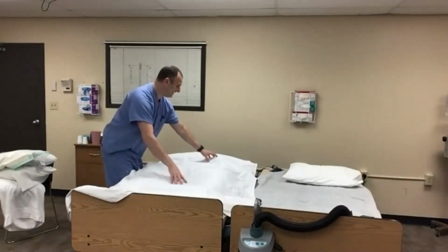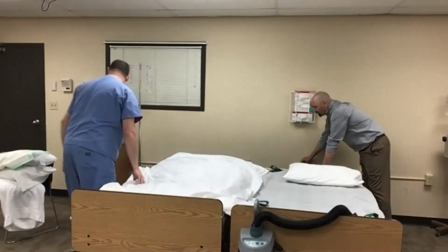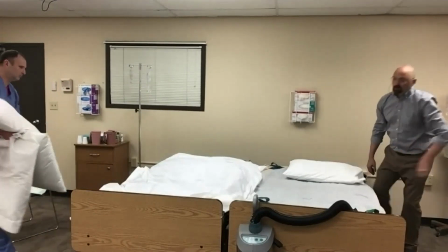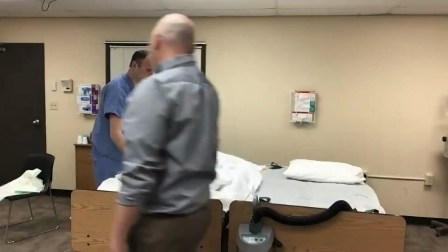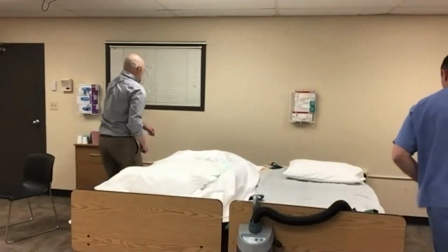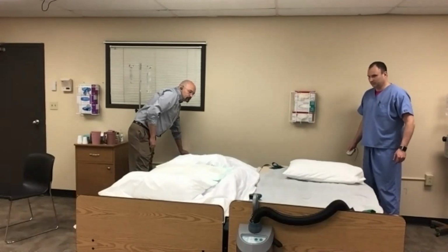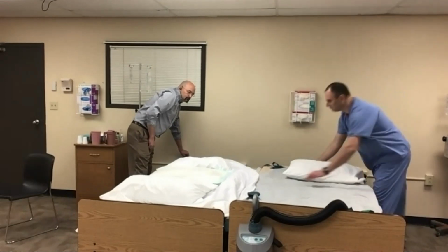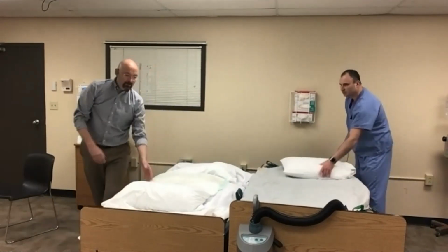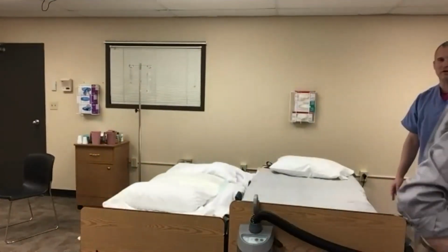Non-safe patient handling. But I think it's important for you to see how easy and how fast these people can move when it's somebody who actually has weight to them. So we're showing you something that doesn't involve enough people, just so you know.